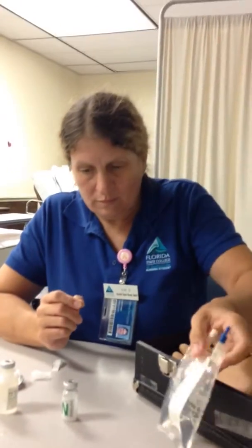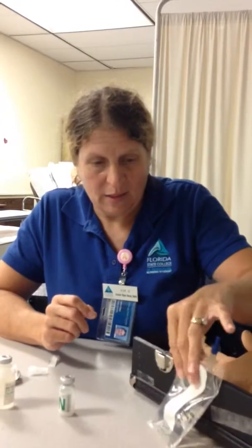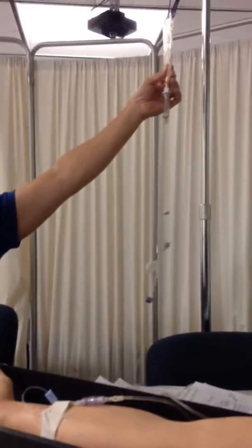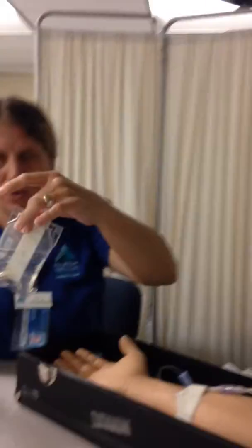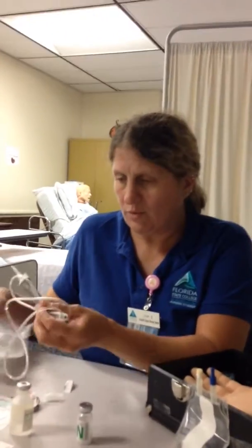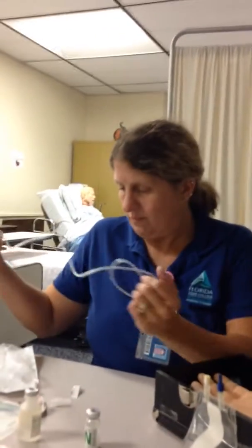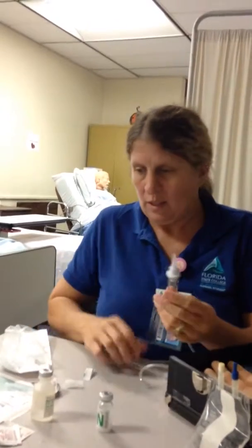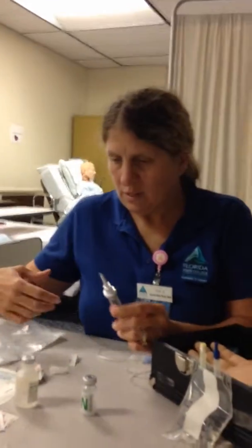In order to hang this, I'm going to have to hang the primary lower, which I have done. So the primary will hang lower, and this will hang higher so that it will infuse into the patient. And then when it's through, I will disconnect this and reestablish the normal saline. So this is my secondary line. It is right out of the package, sterile. It has an attached alligator clamp, so the clip is on it, and it's sterile.